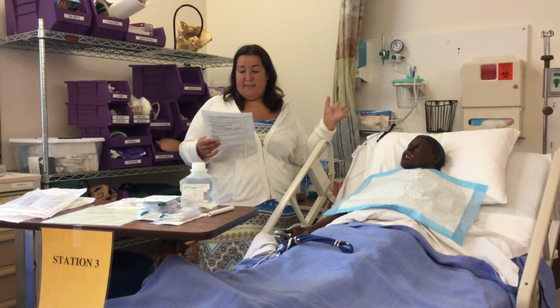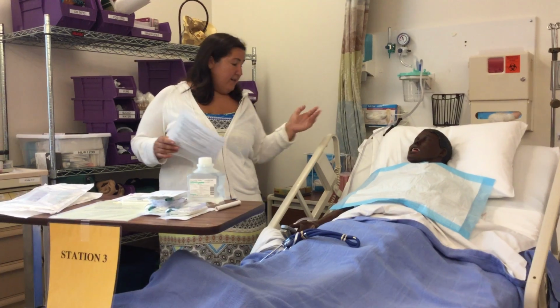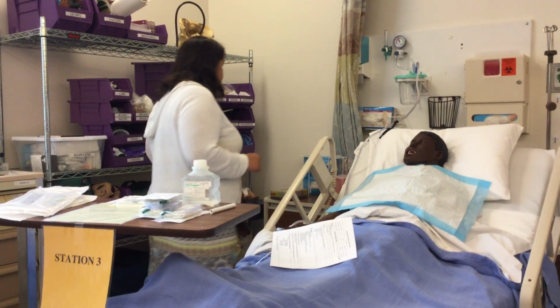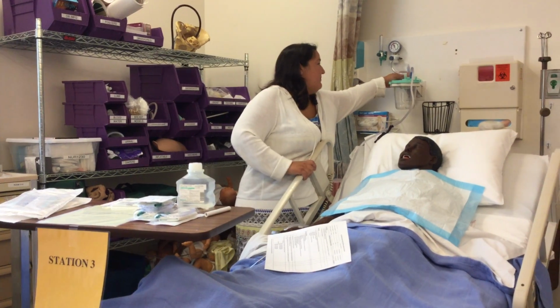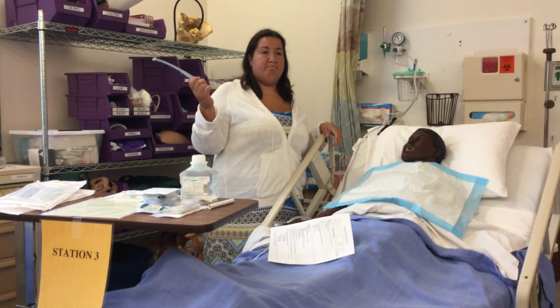So you want to make sure before you get started and you get sterile, you have everything you need in here. A Yankauer. Do we have a Yankauer? There's one over behind me. Oh, here it is. Okay. And this is your Yankauer. What is this? Oral suctioning.